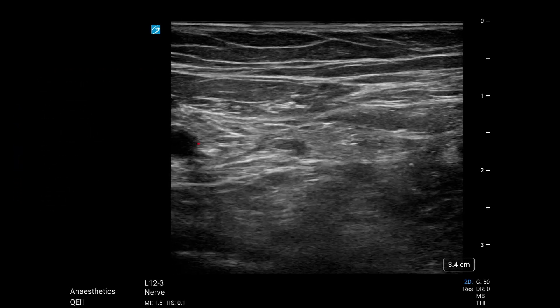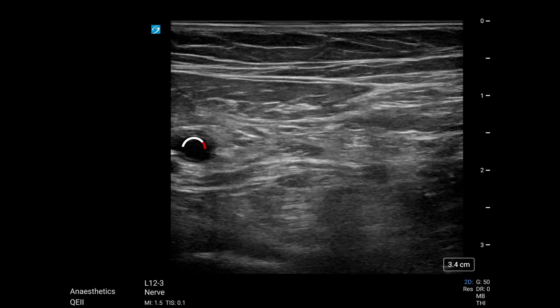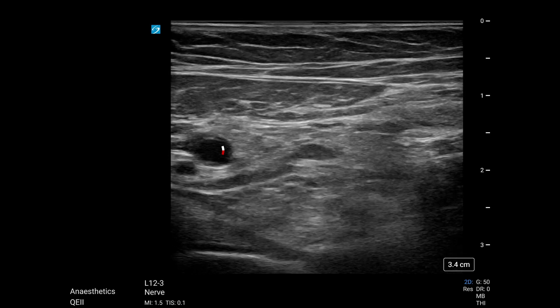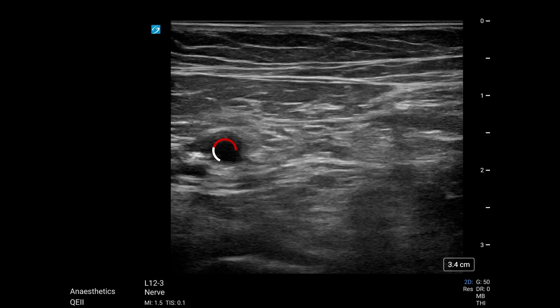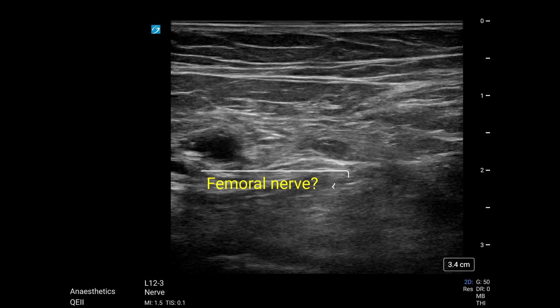As you can see by the size of the artery, this is a small adult. This is the common femoral artery — we're already above the bifurcation, so we know we're in approximately the right spot. We've had trouble identifying the nerve, and that's in spite of the usual ultrasound manipulations, respecting the fact that the femoral nerve exhibits a lot of anisotropy.